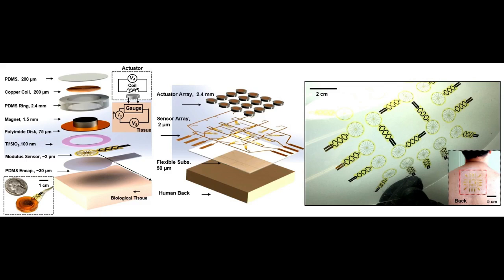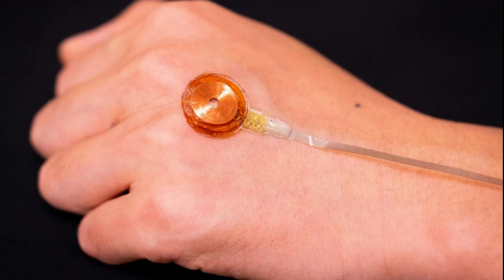These simple measurements have potential clinical significance in rapidly identifying and targeting skin lesions, with capabilities that complement those of recently reported methods for sensing mechanical properties at tissue surface, typically micrometer scale. Cancer tissue is typically stiffer or softer than normal tissue, and such difference can be used as a diagnostic biomarker for a range of skin conditions like skin cancer or tumors under the skin.